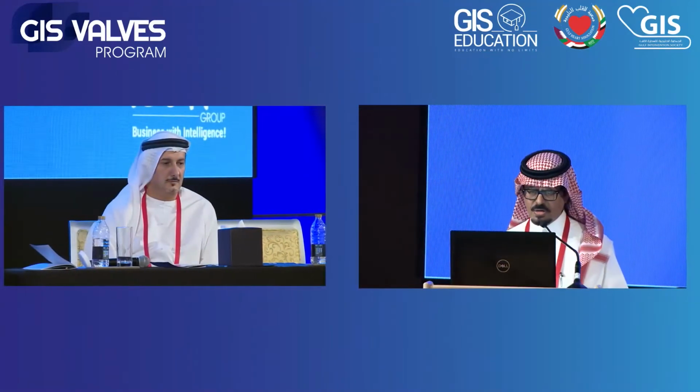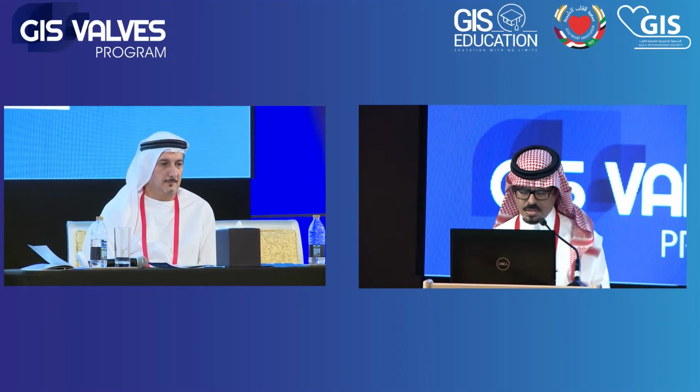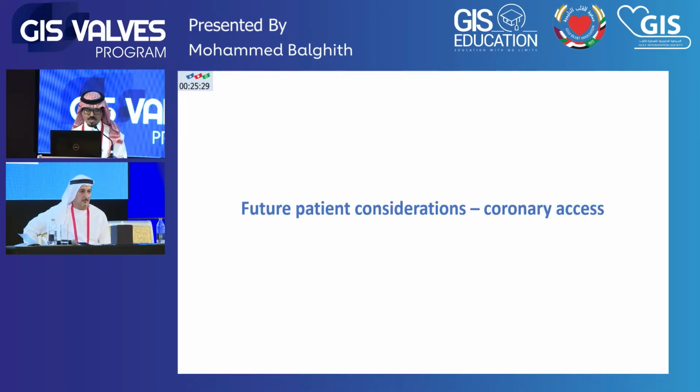Regarding future patient considerations, the hemodynamics, as we mentioned and as we heard in the first lecture, with structural valve dysfunction, sometimes it's structural and sometimes non-structural. Here they are comparing the Evolut and Portico, both self-expandable, and even in comparison with the balloon expandable Sapien, this valve had good performance.